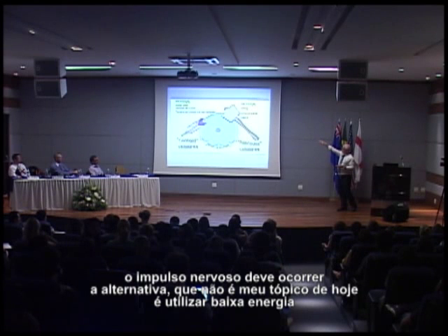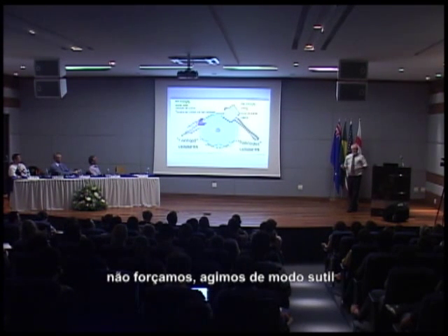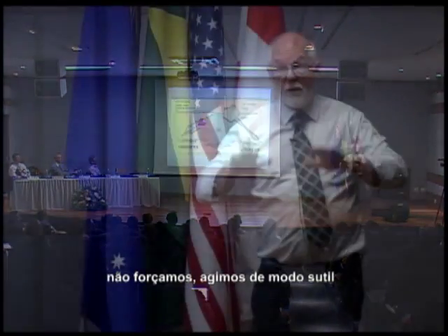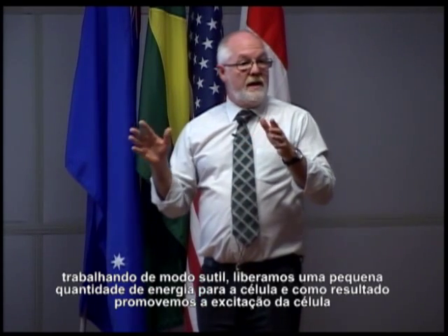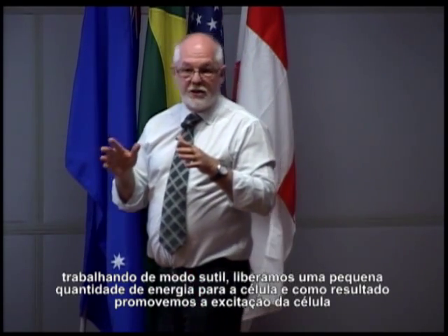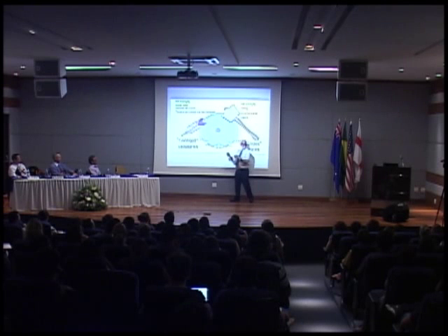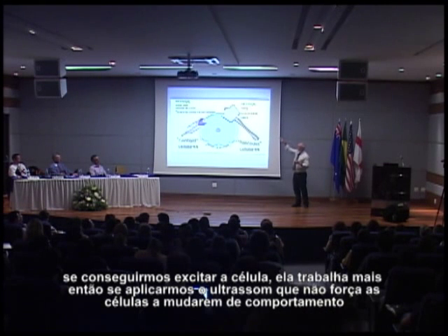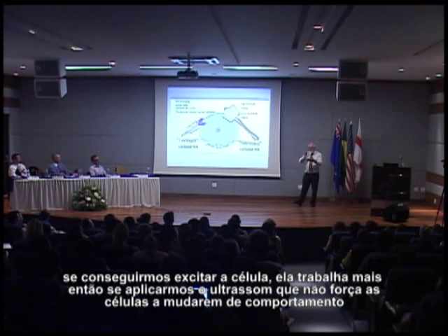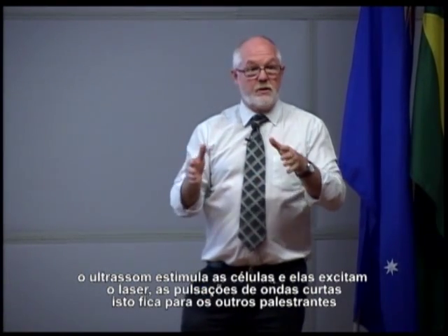All right? The alternative, and this is not my topic today, the alternative is to use low energy. We don't go in strong, we go in gentle, subtle. And by going in gently, we simply deliver a small amount of energy to the cell, and as a result, we get the cell excited. If we can get the cell excited, it does more work. So if we use ultrasound, ultrasound does not force cells to change behavior. Ultrasound tickles cells, and cells get excited.